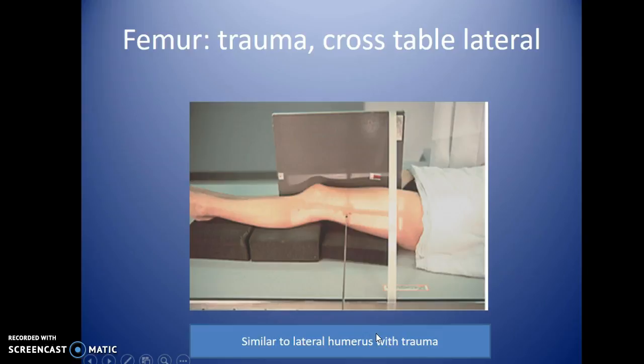This shows the cross-table trauma view. If the patient can't move their leg and you suspect a femoral break, place a long cassette from just underneath the knee up as far as you can, going between the patient's legs. Then do a separate trauma view for the upper area, which will be discussed next semester.